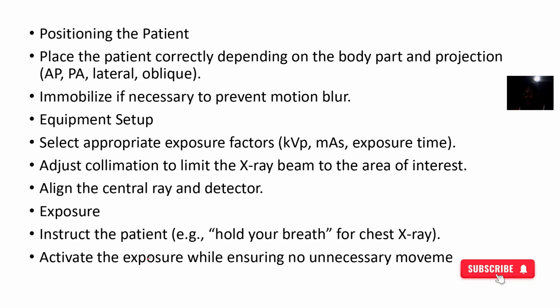Position the patients well, which in the next lesson we'll be talking a lot about, all those positionings in radiography. Also, if you are to use anything to keep the part of the patient immobile, if this will aid you in getting a clearer image, then use it.